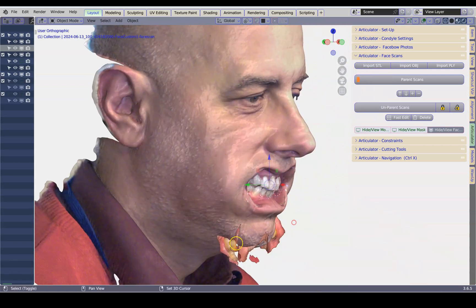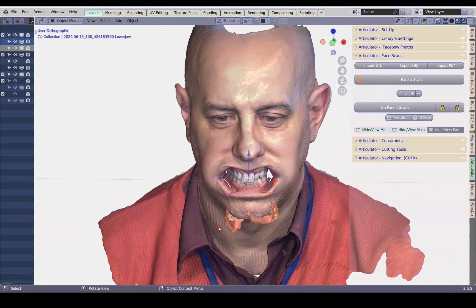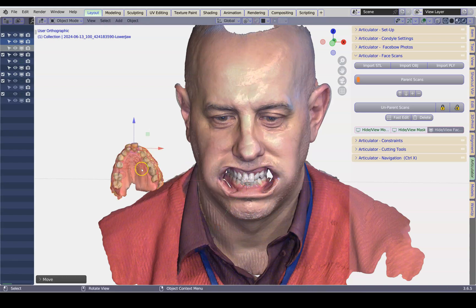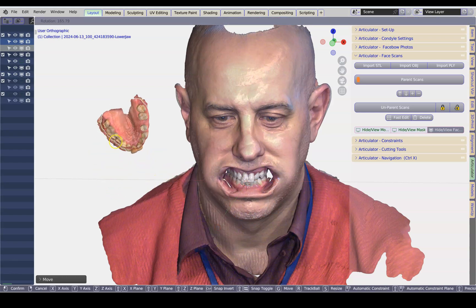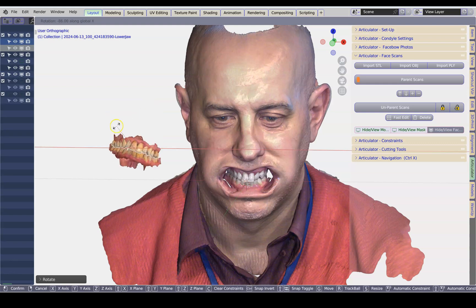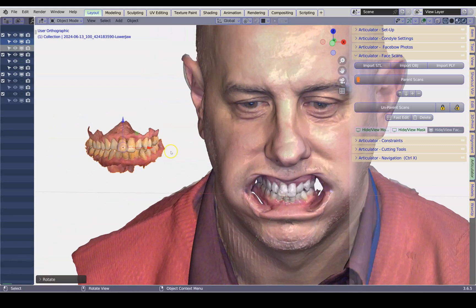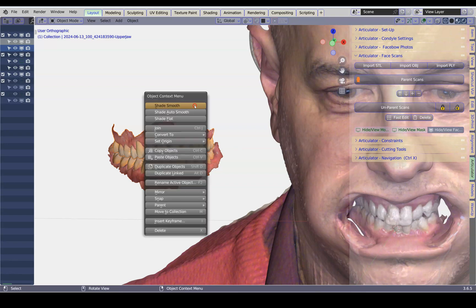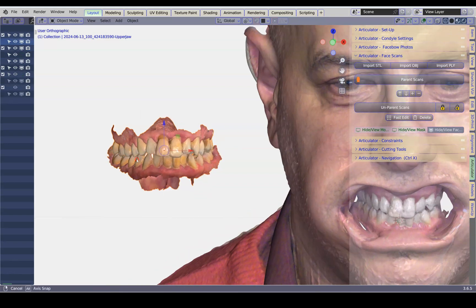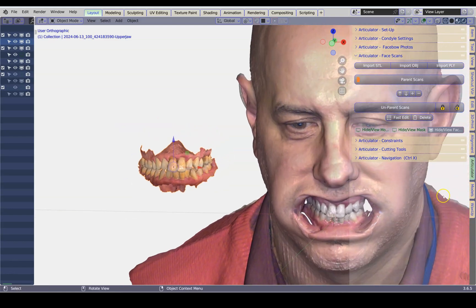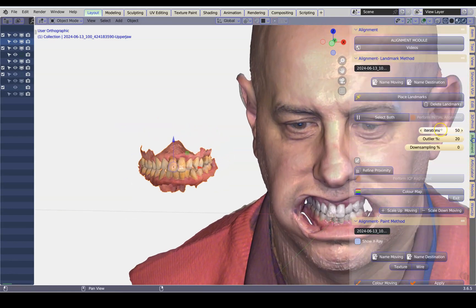I'm going to select both of these and just move them a little bit to the side. We can rotate them with R or X. I'm going to join these up — select, select, Control J on the keyboard, or right-click and join, or find yourself a join button in one of the modules. Go to the alignment — this is our moving object and this is going to be our destination object.